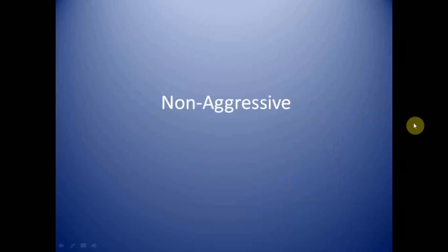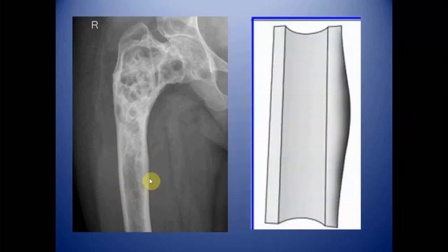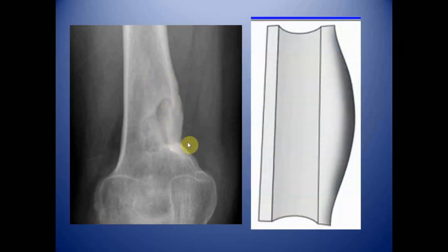In non-aggressive patterns: this case of extensive fibrous dysplasia involving the right femoral head, neck, and proximal diaphysis shows a thin unilamellar type of periosteal reaction in this benign entity. This case of chronic osteomyelitis involving the distal metaphysis of the femur shows thick solid periosteal reaction.